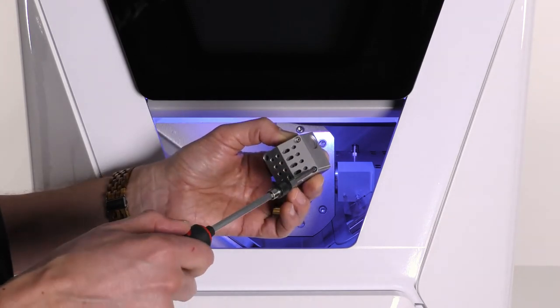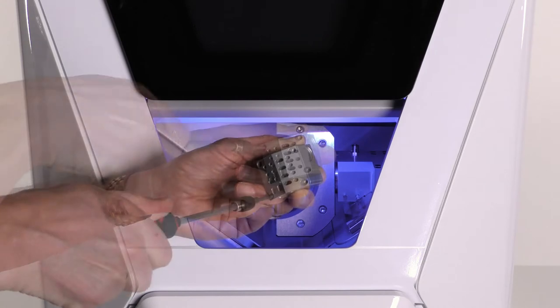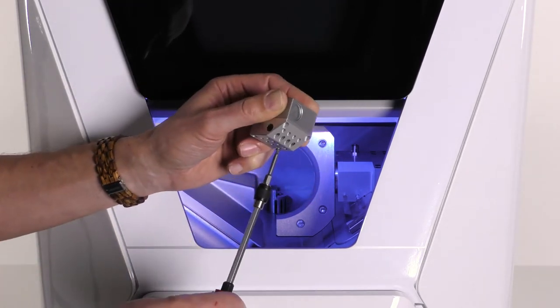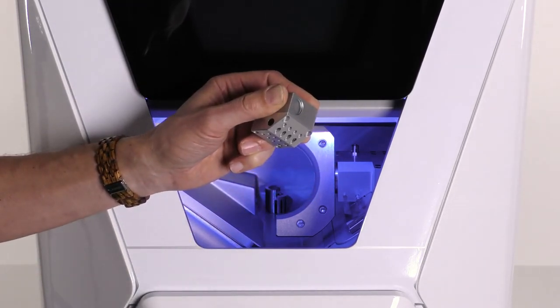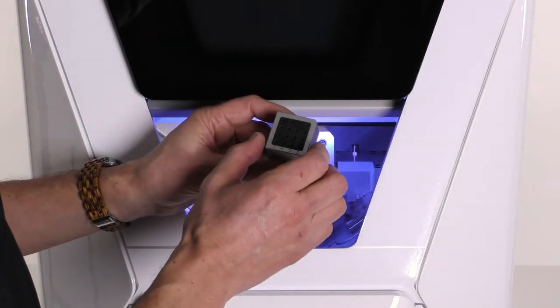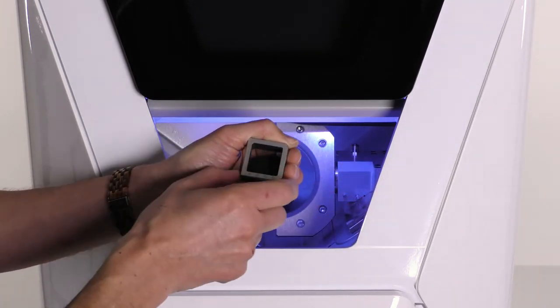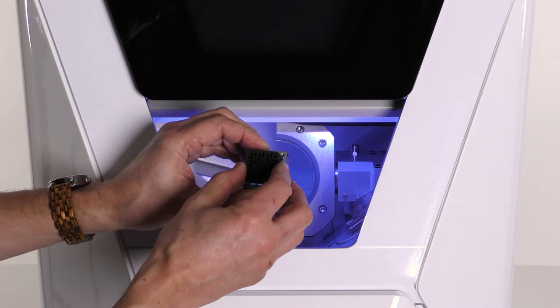For the R5, unscrew the four screws on the bottom side of the tool magazine. For the N4 Plus, unscrew the two screws shown on the illustration. Lift the cover off the tool magazine, remove the existing tool magazine insert, and replace it with a new one.